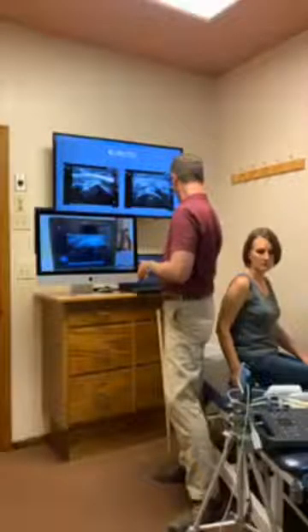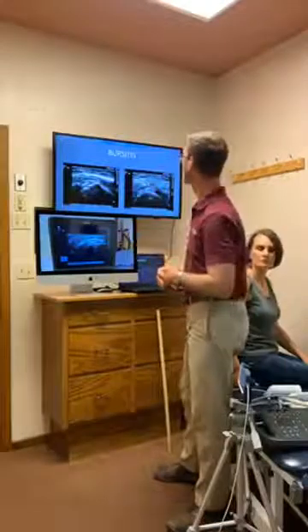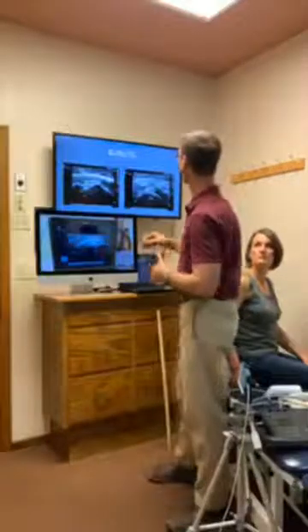Okay, so another problem that we frequently see is bursitis. All right, so this is what bursitis looks like on a diagnostic ultrasound. What is bursitis? Let's talk about that. Bursitis is an inflamed bursa. Bursa are fluid-filled sacs which help decrease the friction between tendons and bones, typically. All right, and there's the subacromial bursa, very frequently a site of inflammation and pain, along with impingement and other issues, which you'll see right here, but it gets swollen, all right?